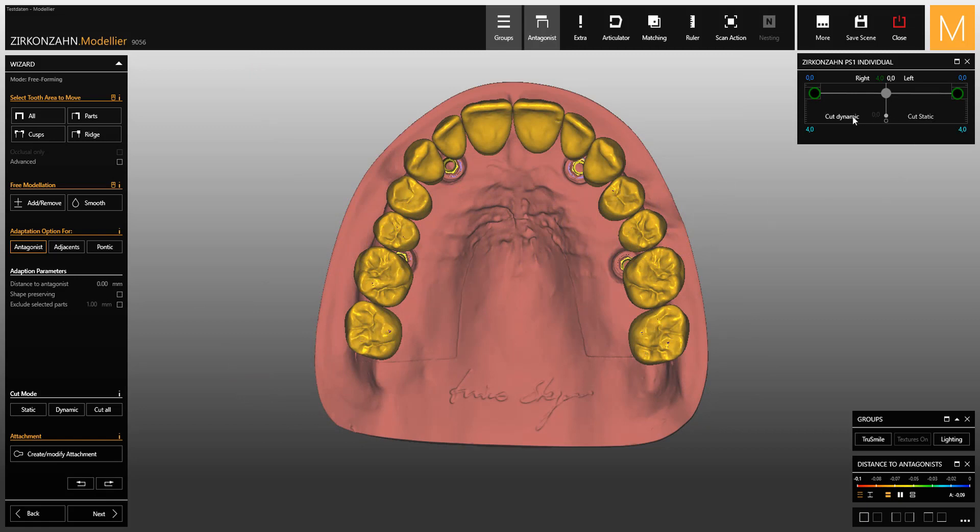In this window you can see the antagonist.